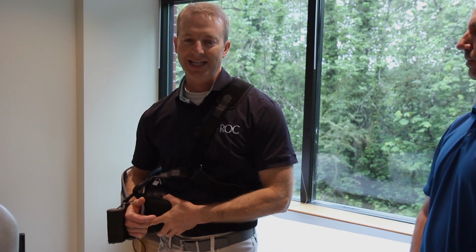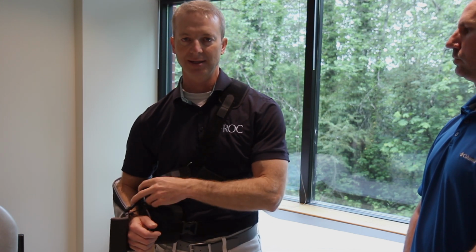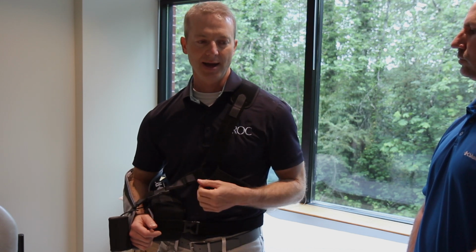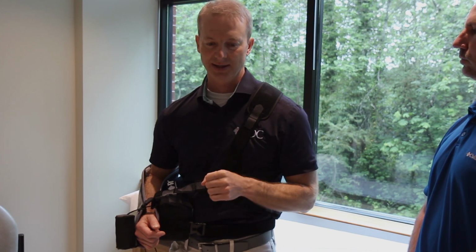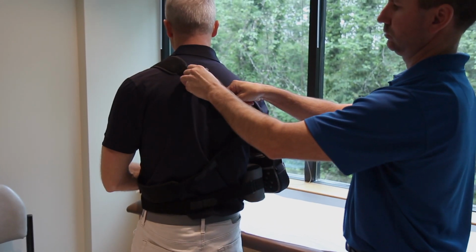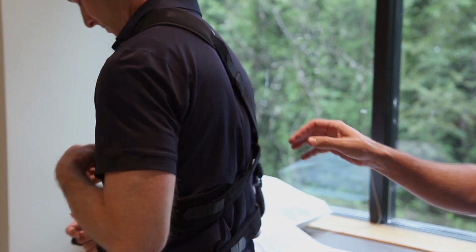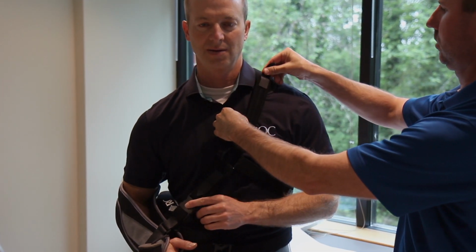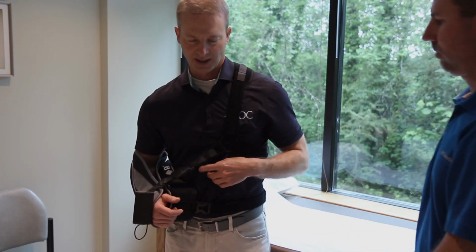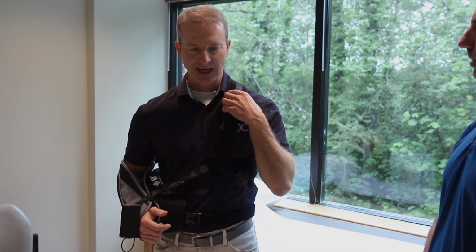like so. The next thing that happens is the sling may not be adjusted perfectly, and you may find that your arm is not being well enough supported, that it's not doing an adequate job of supporting the arm, such that you can relax your operative arm into the sling. And in this scenario, it will need to be adjusted in terms of the tensioning. And so we'll demonstrate that. So each of those 4 adjustments can be used to retension the straps so that you have appropriate support for your arm and for comfort.